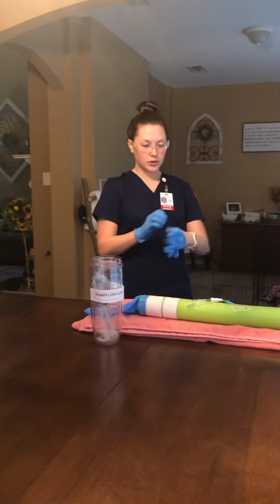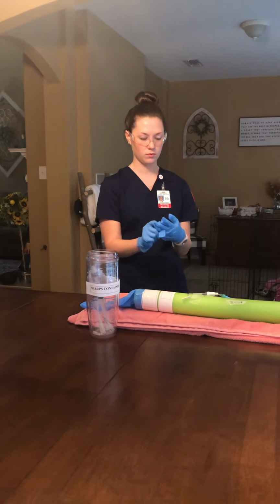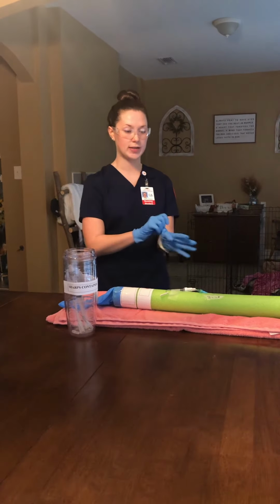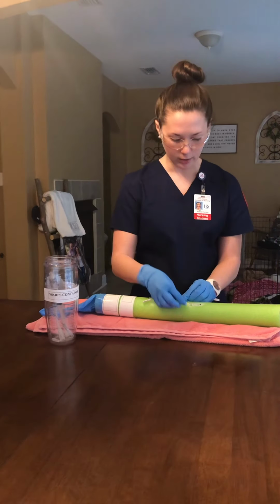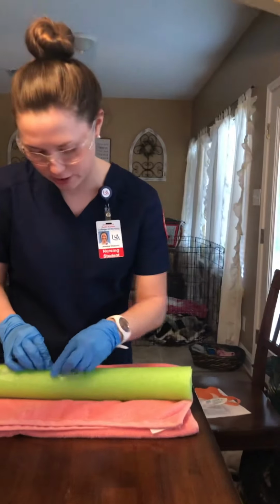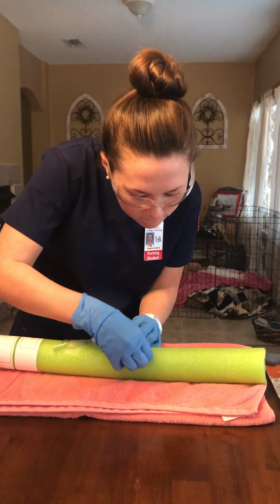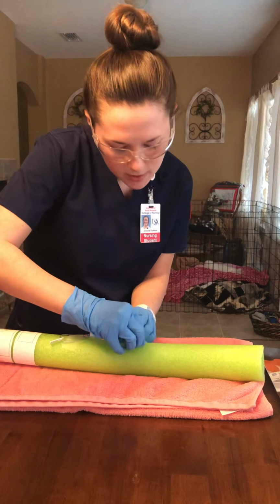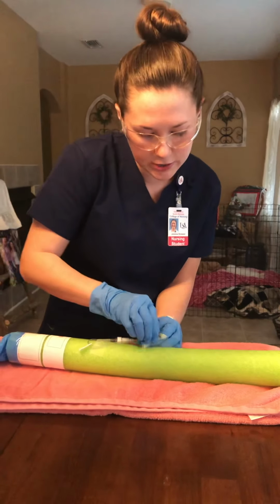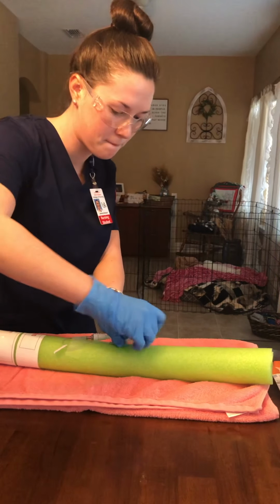So now what I would want to do is make sure that I stabilize the catheter. Now I'm going to remove the dressing. I'm going to do this towards the center of the injection site. If I can get it up. There we go. So I'm going to be pulling towards the center of the injection site while I'm removing.